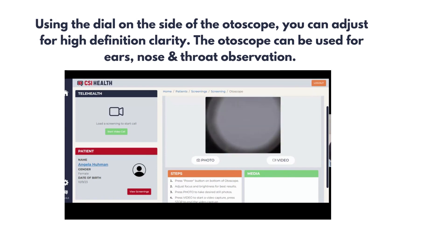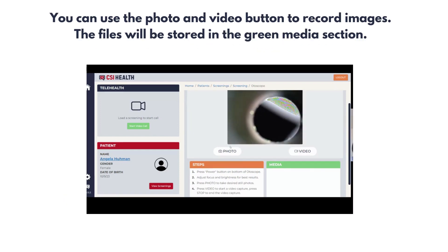The autoscope can be used for ears, nose, and throat observation. You can use the photo and video button to record images. The files will be stored in the green media section in the lower right-hand corner.